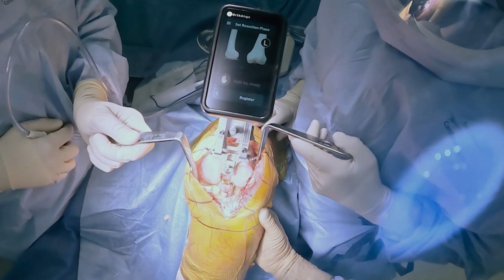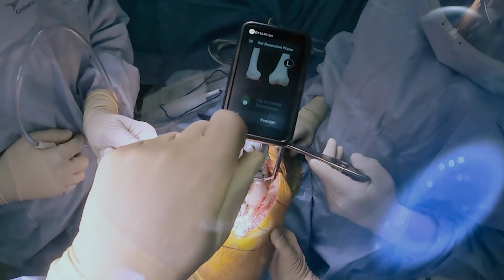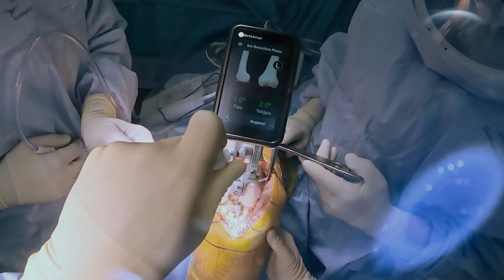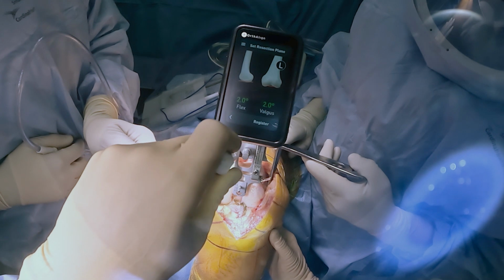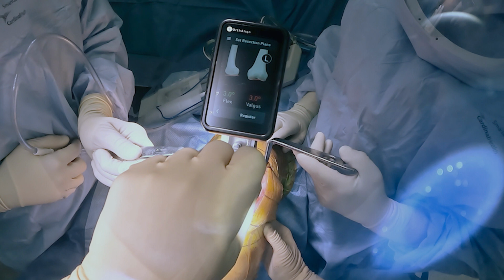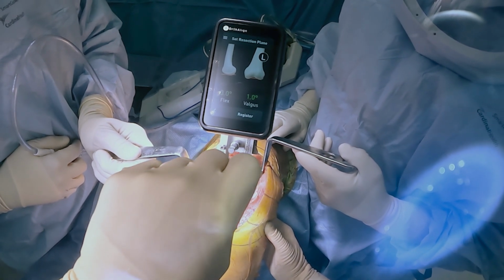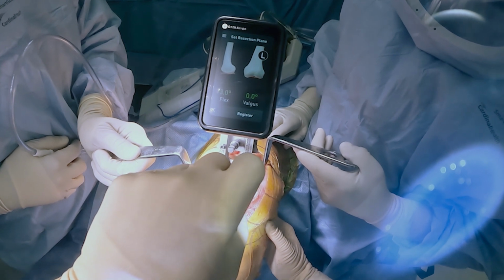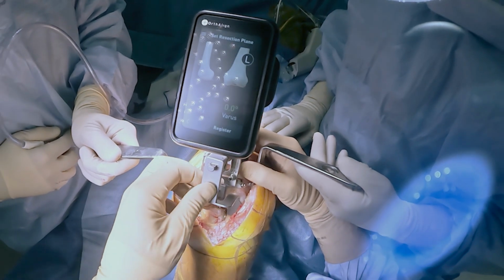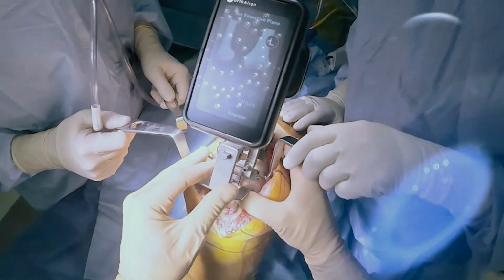Here we are after registering the mechanical axis, and you can see how easy it is to use. I'm adjusting the varus valgus angle. I'm personally using a neutral mechanical axis with a 3-degree flexion according to the AP bow. This takes me approximately 20 to 30 seconds longer than manual instrumentation. However, it's very easy to use, as well as the computer system makes it a very friendly user interface. As you can see here, I'm setting my depth of resection, which is approximately 9 millimeters. And this is approximately 4 to 5 minutes into the case, which is average for me.